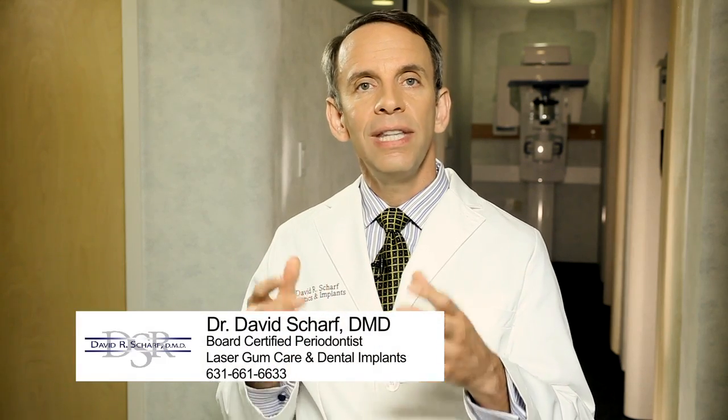As software developed and computer power developed, Simplant Software came into being. And Simplant Software allows us to load a patient's CAT scan data onto a computer and then interact with that CAT scan data. So we can not only take measurements, but we can place the implants virtually. We can do virtual implant surgery. That allows us to fine-tune what implant to use, the dimensions of the implant. It allows us to analyze the density of the bone surrounding the implant so we know how long we'll have to wait. We'll know, is that bone adequate to support the dental implant?